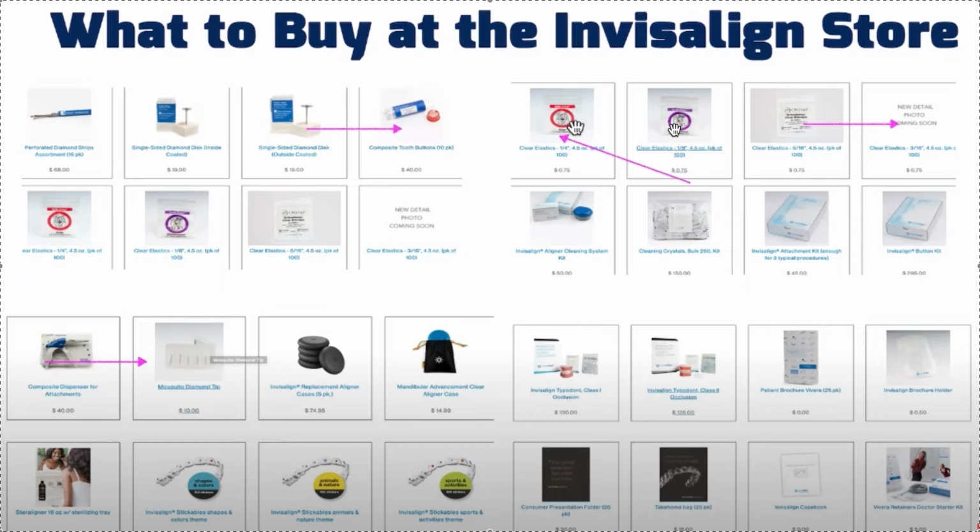Elastics, no reason to get them from the store. They're pretty cheap, and I think you can buy one at a time, which is good. You can also just get them from eBay, but it's about the same price. If you're doing a lot, you're going to want to get them more in bulk. But definitely in terms of elastics, I think you should buy medium quarter, medium 3/16. I don't think they have heavy. The heavy ones you're going to have to get from eBay or from an ortho distributor, but anytime you buy from an ortho distributor, you have to buy in gigantic portions. So eBay will let you buy just one bag.